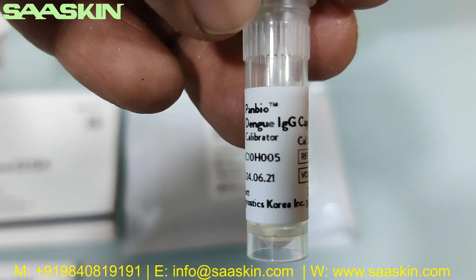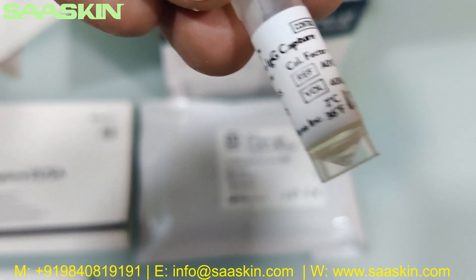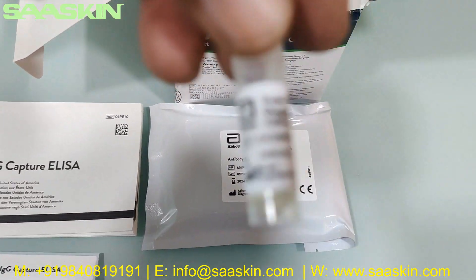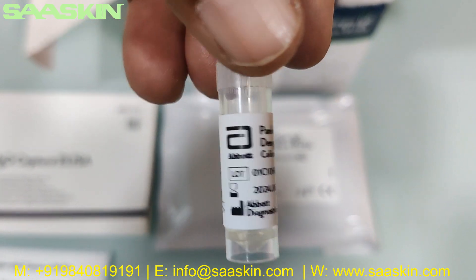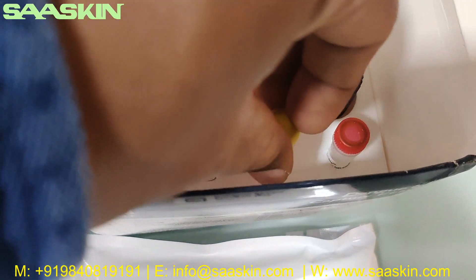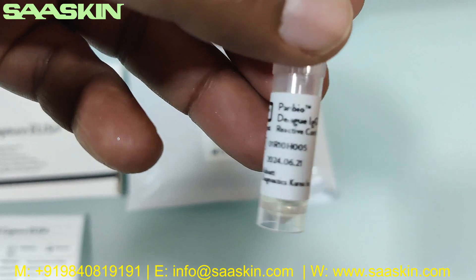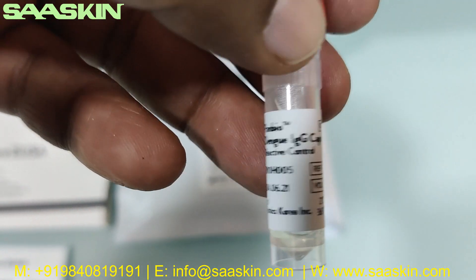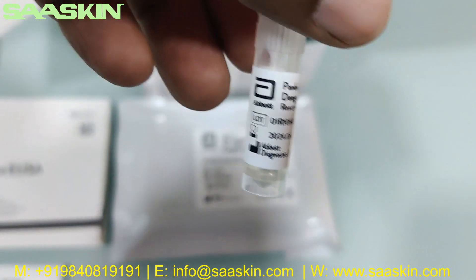The next one is the Panbio Dengue IgG Capture calibrator, and this is 400 microliters. And the last one I have here is the Dengue IgG Capture reactive control — so that is 200 microliters.